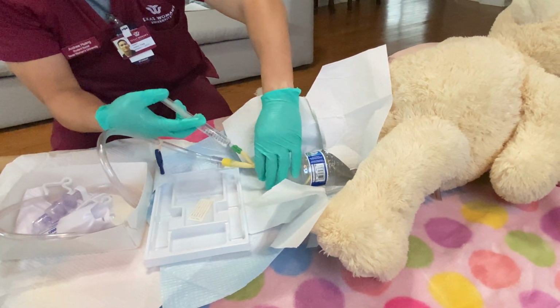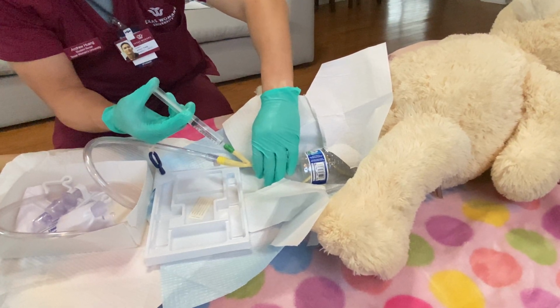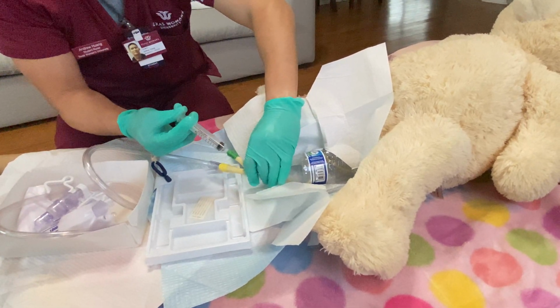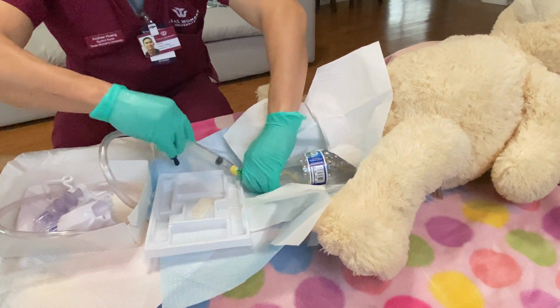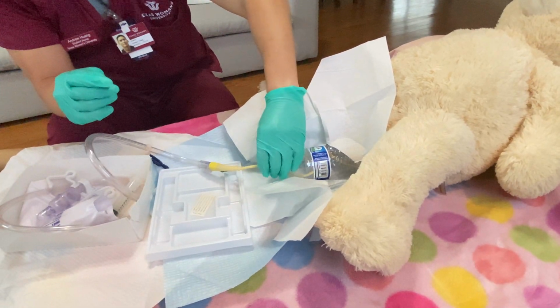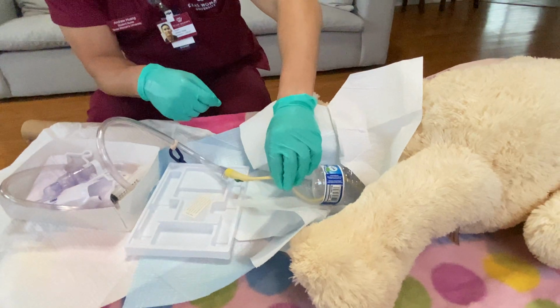And I'm going to inject the normal saline. And while holding the syringe plunger, I'm going to twist off the normal saline. And now I'm going to feel for resistance. And I do feel some resistance so that the catheter is in place. Okay.